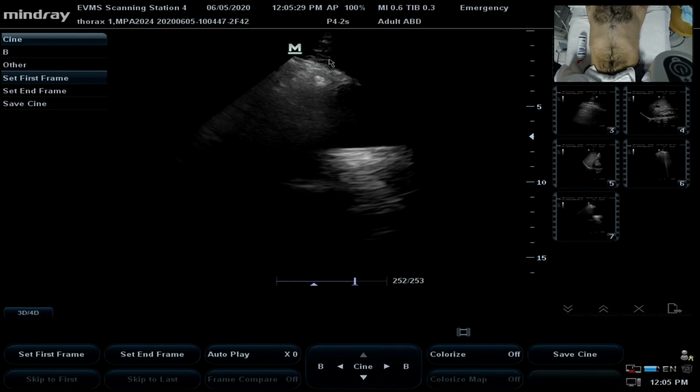I want you to look at these anterior rectus abdominis muscles, and you'll be able to decide if you're inferiorly enough, because you will see these muscles diving posteriorly as you move inferiorly, and when they dive deep, that is your proof that you are as inferior and as deep in the pelvis as that bladder is.